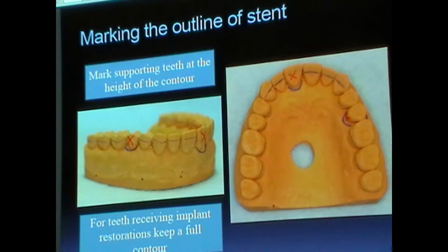When we first put it up, we were missing 17. We changed the teeth last week. So this would just be for the maxillary arch. So this should be a central incisor and a premolar. So that would be either 8 or 9, or 12 or 13, I believe. Or it could have been 5. Very confused. Okay?